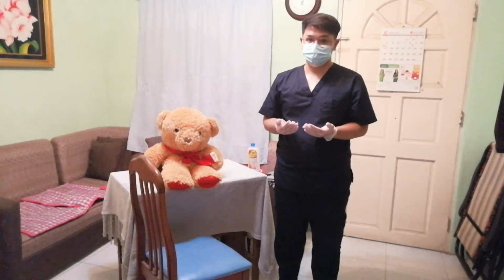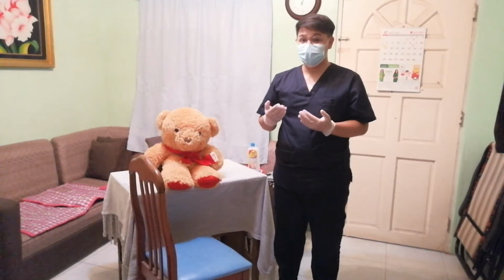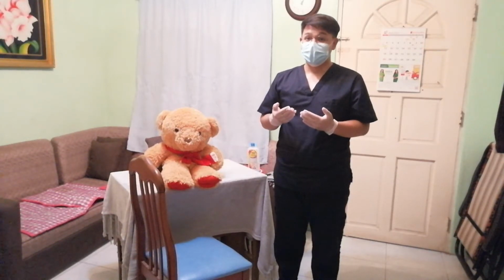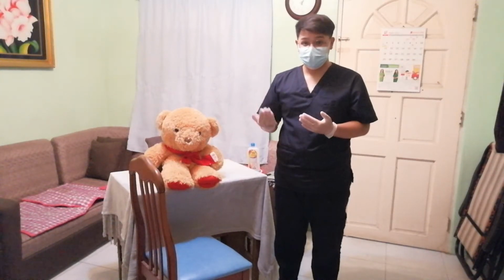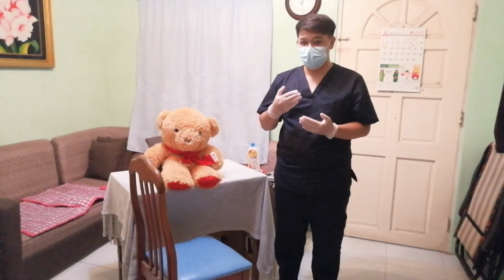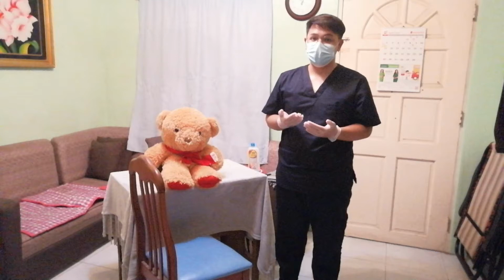After that, for our 10th step, we need to stand in front of our patient and assess the patient for any balance problems or any complaints of dizziness. And after that, we need to allow our patient to dangle his or her legs for a few minutes before continuing.